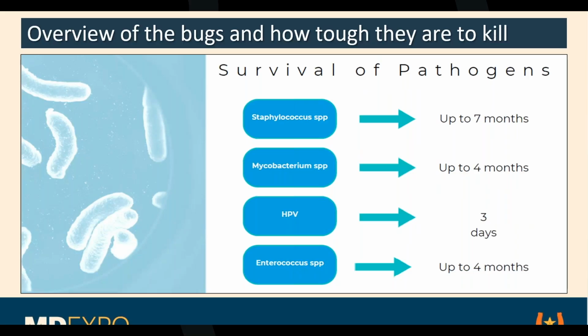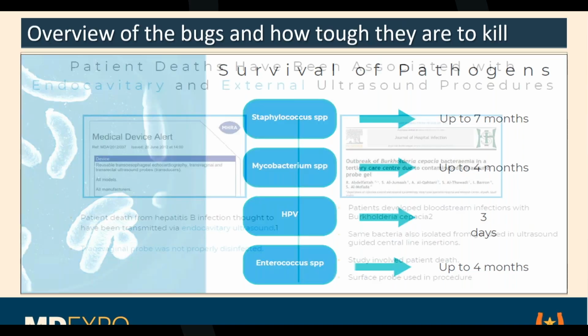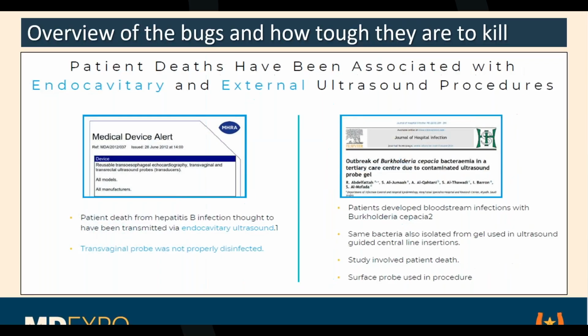So some of them live up to 7 months, some of them live 3 days, like the HPV, some up to 4 months. So it all goes into that arena. And it's safe to say that patient deaths have been associated with both endocavitary and external ultrasound procedures.